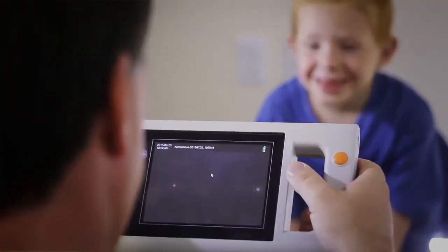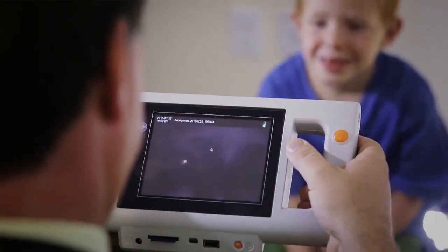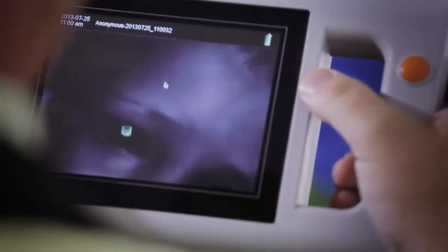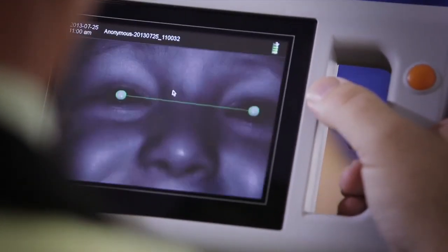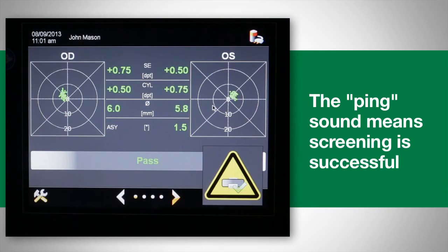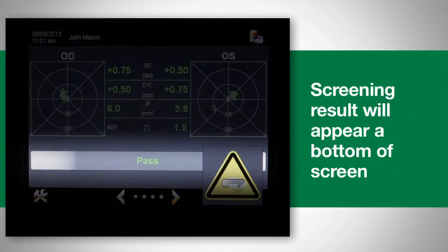Align the device so you can see both of the child's eyes on the screen. Move slowly toward the child until green circles appear around their pupils. A green line will appear between the pupils when the correct distance is achieved. The measurement begins automatically, and a ping sound indicates a successful screening.